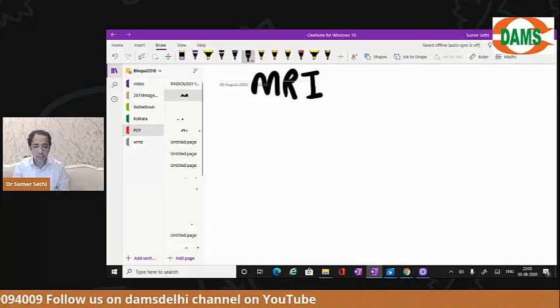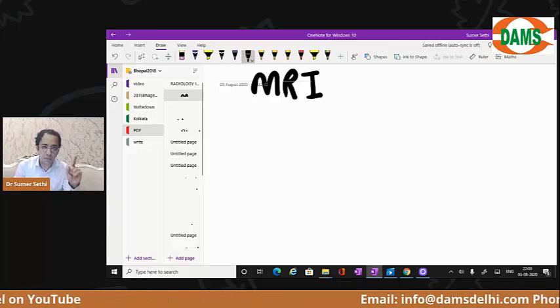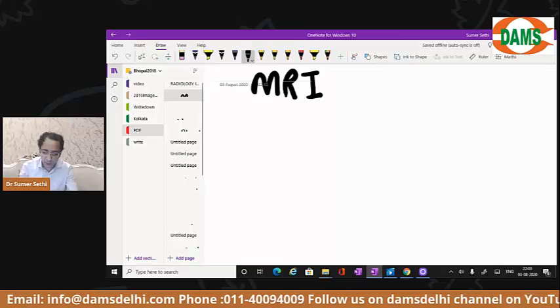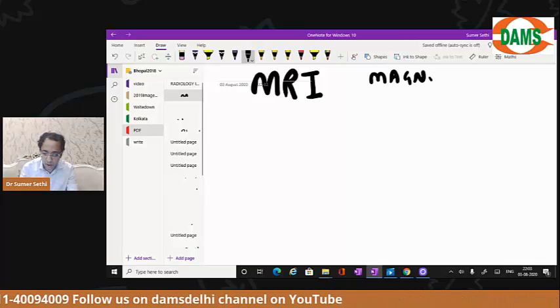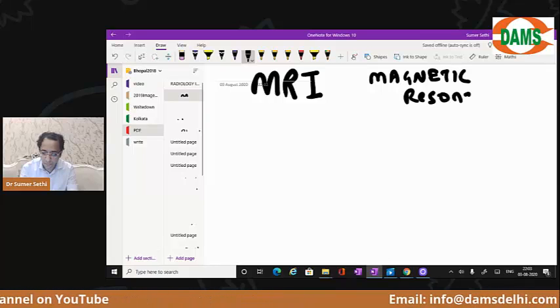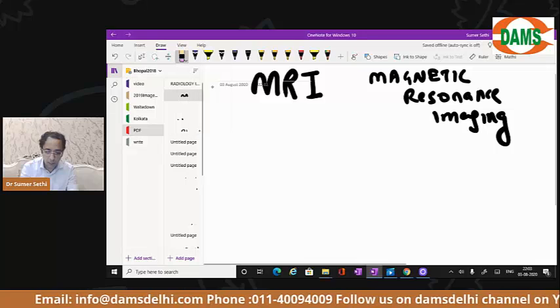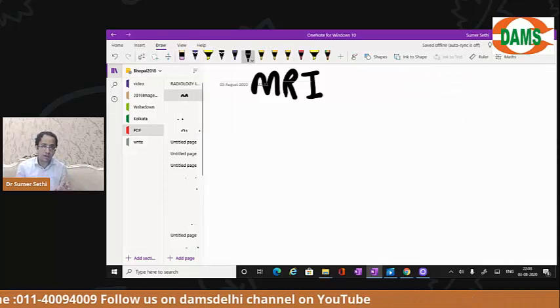First line of the day is MRI. Just like in my first class I started with the word CT scan, today I am starting with the word MRI. Everybody write down MRI. MRI stands for magnetic resonance imaging. That means it has to do something with the magnetic field.